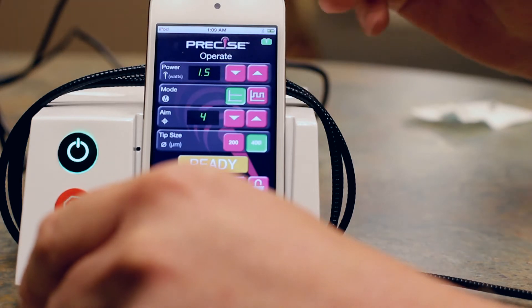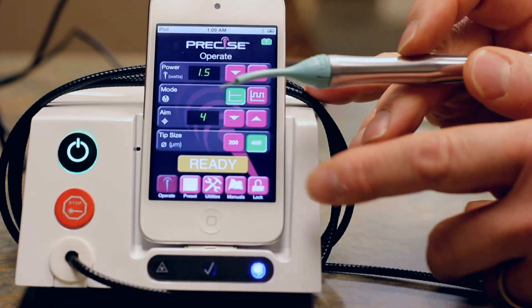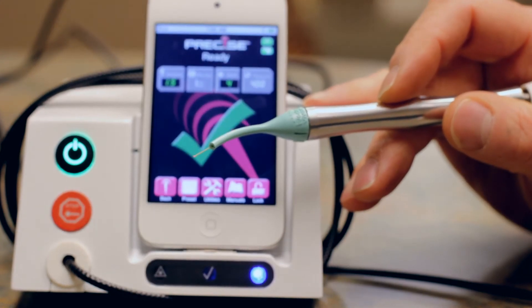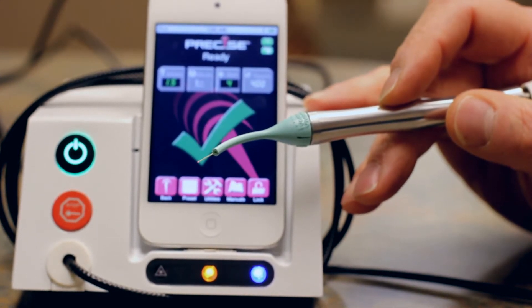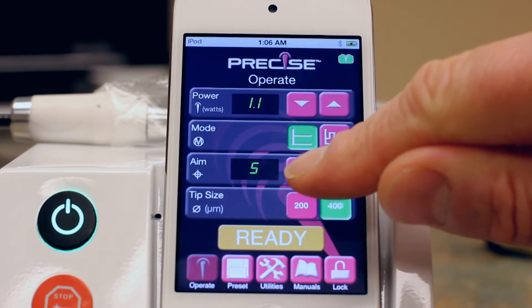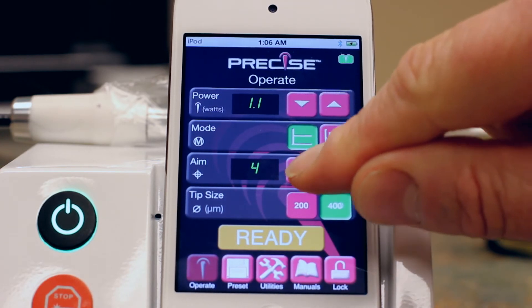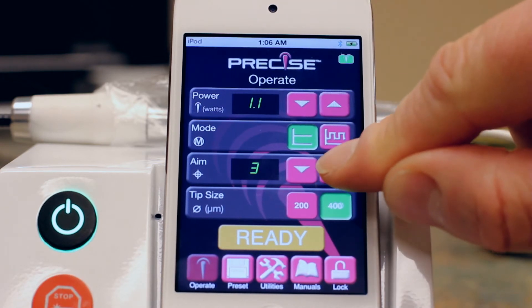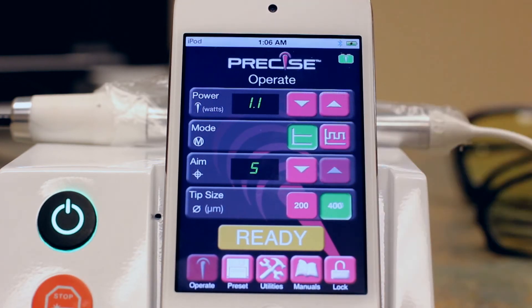The aiming beam is a visible red laser light that is much lower in intensity than the 810 nanometer main beam. The aiming beam has the same intensity as a laser pointer, and that's basically what its job is — to help you see what tissue you're about to treat. Adjust the intensity of the aiming beam as needed; reducing it to its lowest level setting actually shuts it off.